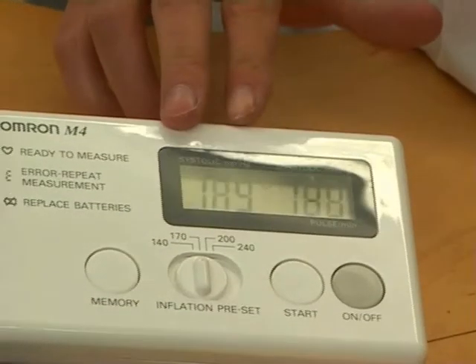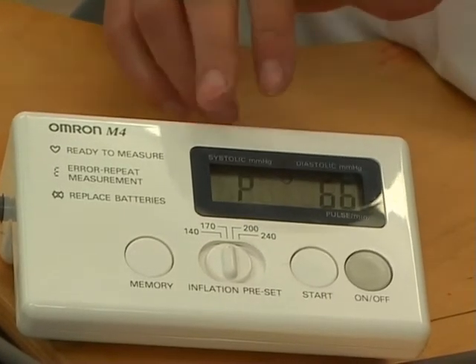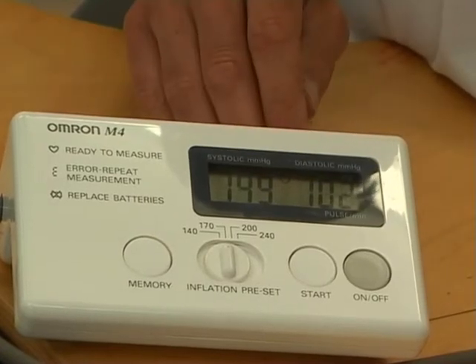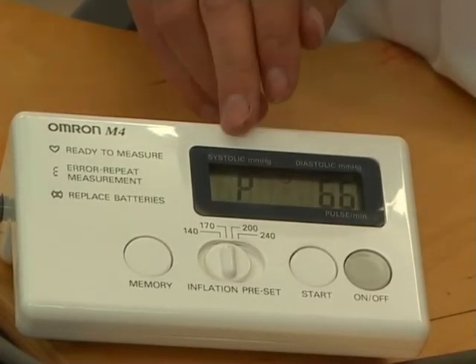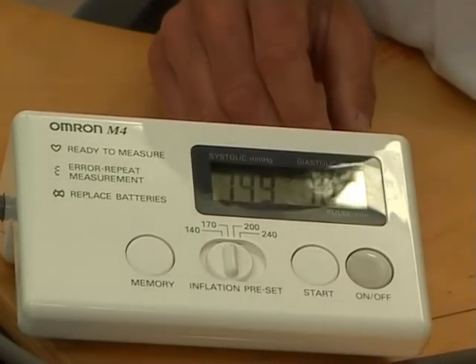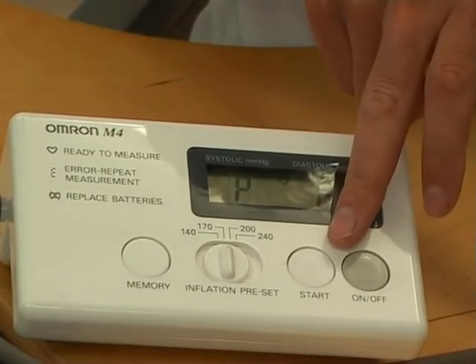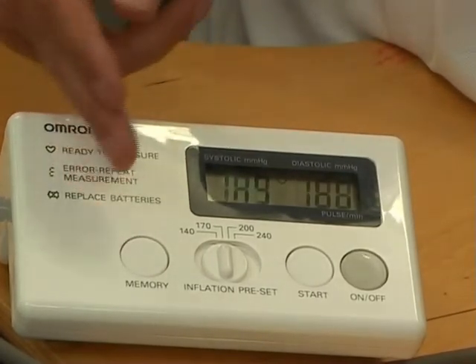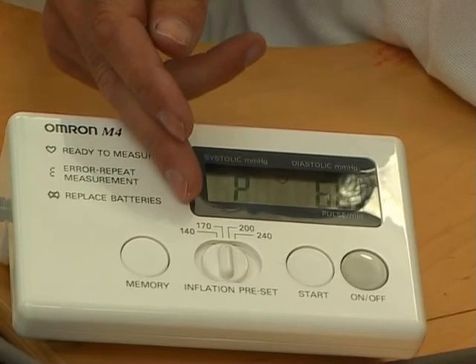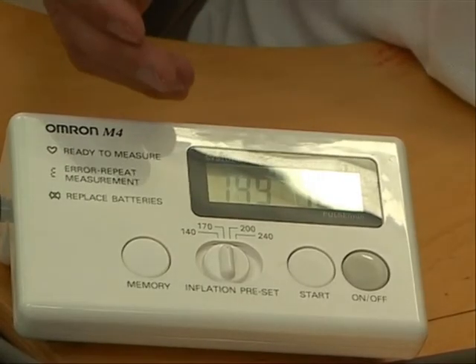We now have some results. This unit cycles through the results collected. Firstly, we have a systolic blood pressure over a diastolic blood pressure — we can see here we have 149 over 102. It will then display P66, which is a pulse rate, so the heart was beating at 66 times per minute, and it will alternate between the two readings. The unit is controlled by an on/off button and a start button. It also has a memory, which can be ignored, and an inflation preset which will always be set at 170 and can be left in that position. If it is not sufficient, the unit will automatically go to a higher level.